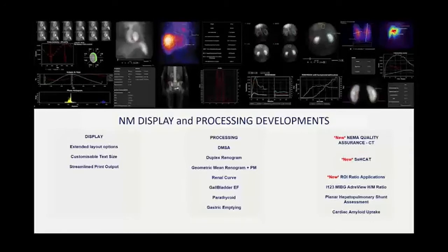As per the newsletter, there are some new features coming. Some are related to display, so improvements in display. You've been saying to us for a long time that you wanted more configurability with layouts, and more configurability with text size in reports, in the report tables. So I'm very happy to say that that is now here. You can optimize the size of your results tables, which will mean they are very impactful when they go over to PACS now.